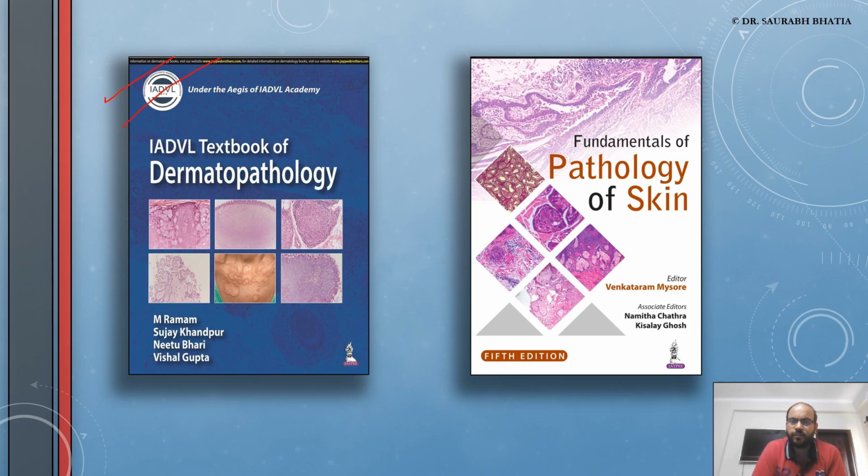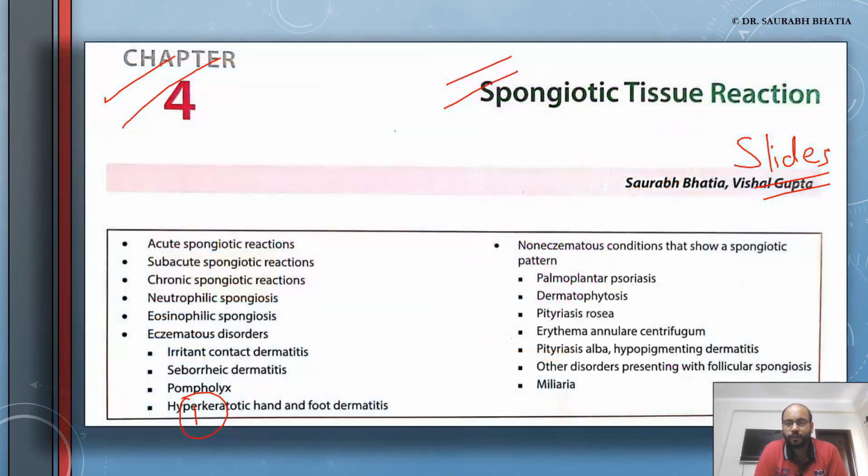So this is a dermatophyte infection. Now remember, if you see spongiosis centered around the upper layers of epidermis, and there is an intense neutrophilic collection around it, think of a parasite. What exactly is happening? Inflammation is happening. That is why there's spongiosis. What exactly is happening? Neutrophils are there. So that is why there's pustule formation. Now, intense inflammation, pustule formation involving the upper layer of epidermis, think that something is attacking from the outside to the inside of the body.